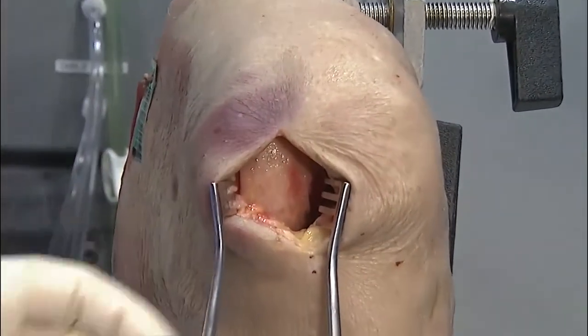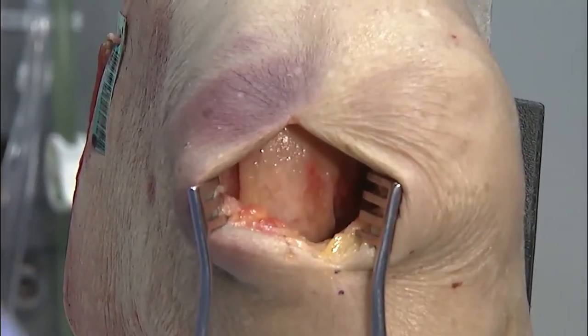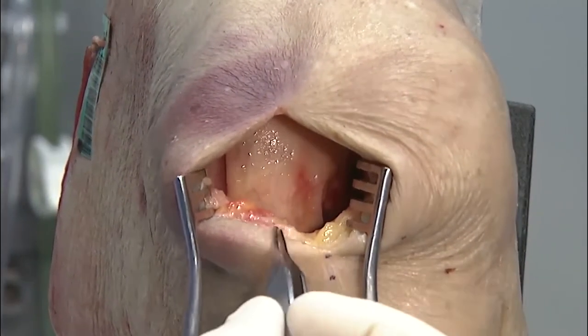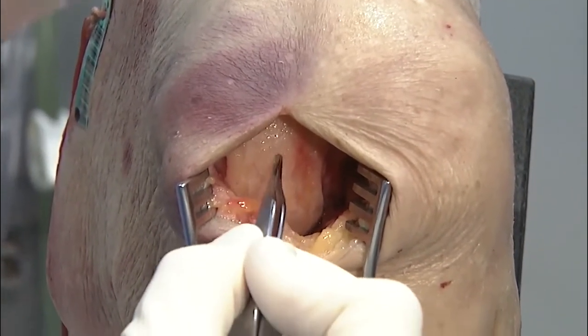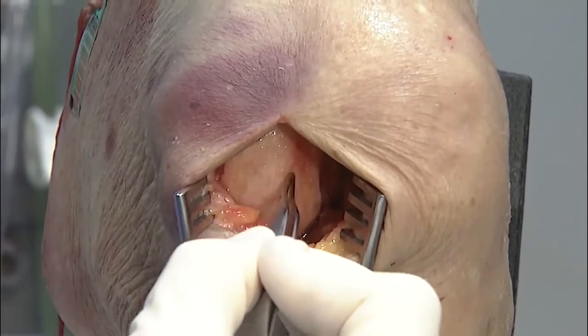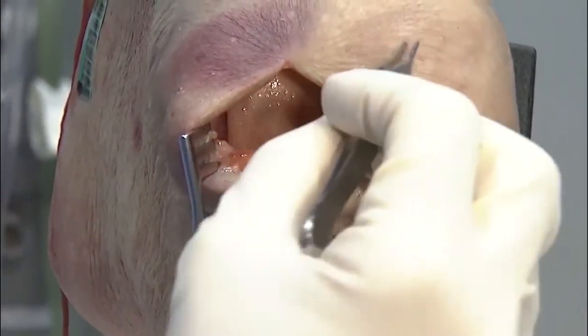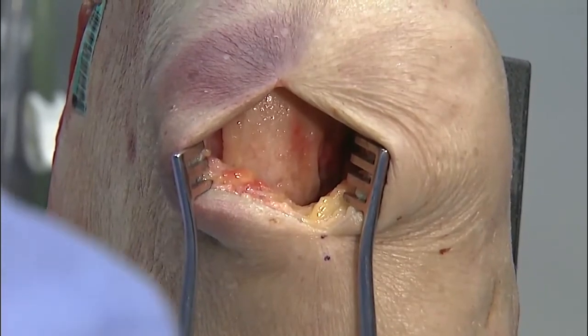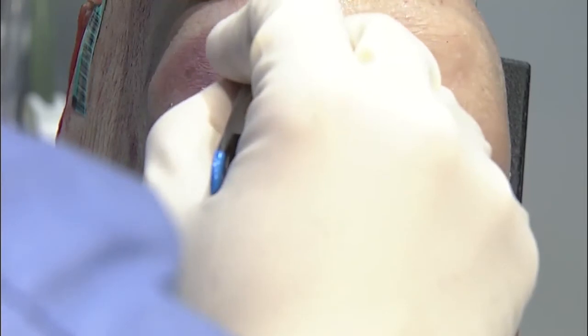This is a medial femoral condyle in a left knee, and I was going to look at this cartilage quality. You can see this cadaver has some arthritis without a lot of cartilage left on that medial femoral condyle, so I'm not sure if I'll be able to get good vertical borders. So what I might do is go over to the lateral side just to make sure that I'm adequately demonstrating the technique.